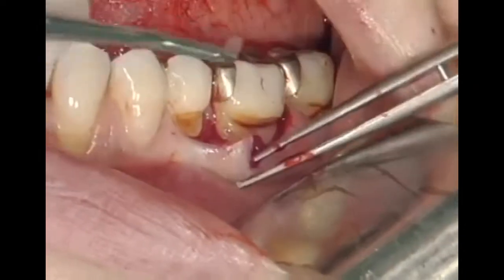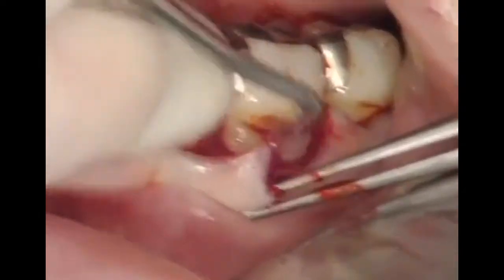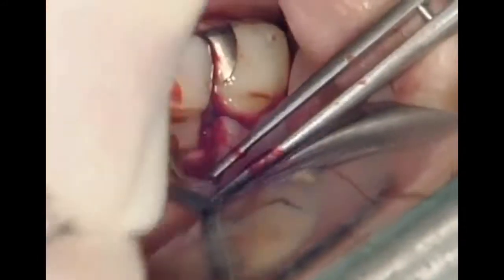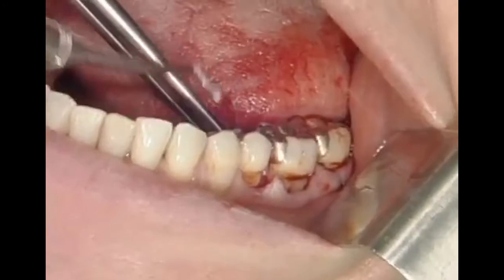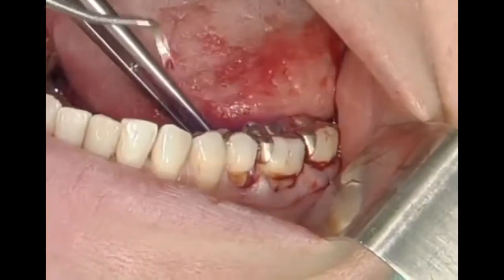A curette is used to remove the granulation tissue from the alveolar bone, as well as any associated osseous defects, so that the root surface is completely visible and fully accessible. Granulation tissue in the lingual area also is removed.